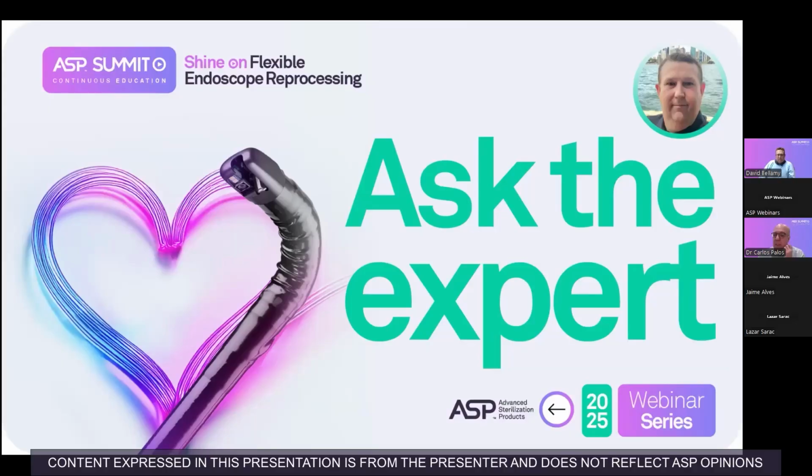And the second question is, what do you think about if low temperature sterilization using the hydrogen peroxide can replace ethylene oxide for all flexible endoscopes? It's increasing, definitely increasing, as the manufacturers of scopes are moving forward. I know some of the newer ones that are coming out can go through low temp hydrogen peroxide, but it will increase. Currently, no, I don't think it can replace ethylene oxide for all flexible endoscopes. Looking at the manufacturer's IFU will hopefully show that, but it's definitely increasing, and I think it will become the popular or the most used sterilizing method in the future.